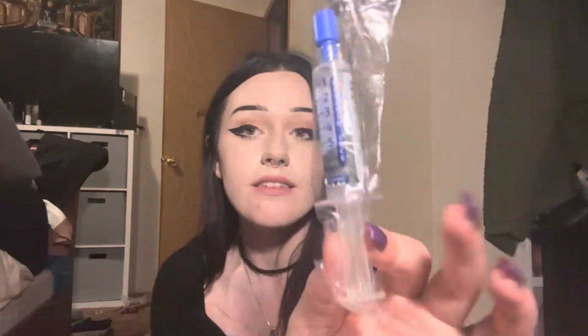And then I got 8 heparin flushes, which I don't know why I got 8. If you don't know what heparin is, this is heparin. This is just what I have on my cart, but this is a blood thinner that you have sit in your line. I have tons of them, so it's not like I'm going to run out, but normally they at least give me 14, so kind of weird.